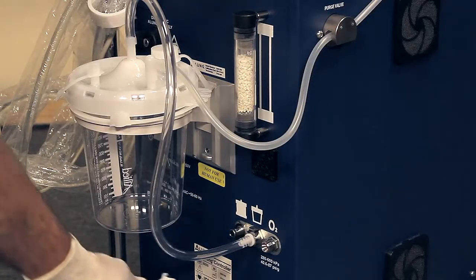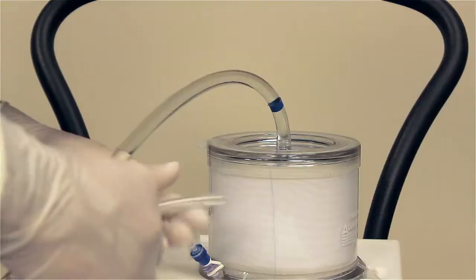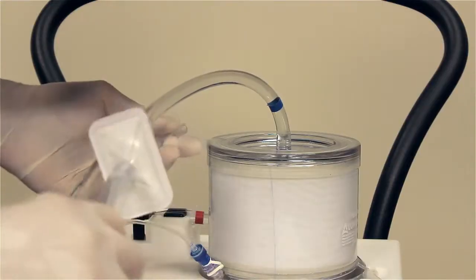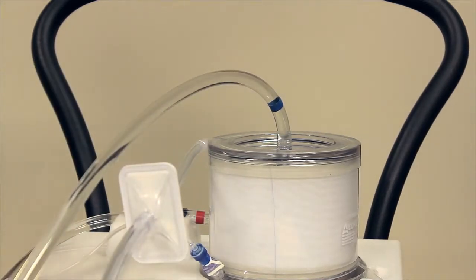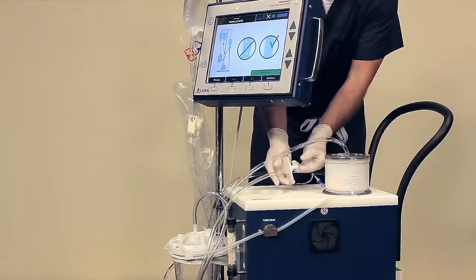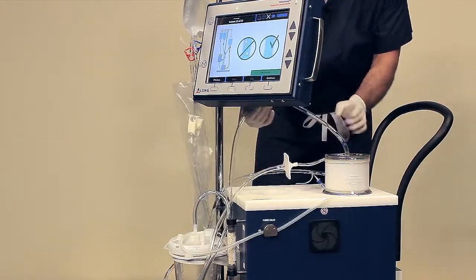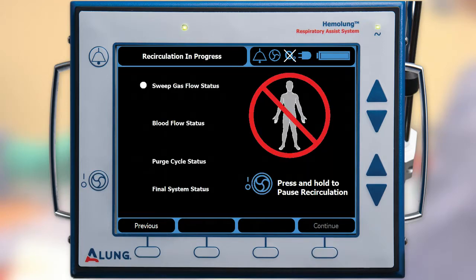Connect the sweep gas supply tube with the bacterial filter to the controller. Connect the other end of the sweep gas supply tube with bacterial filter to the sweep gas inlet port of the cartridge. Make sure all tubing connections are completely secure and there is no air or leaks observed in the circuit. Press Continue to start the recirculation process.